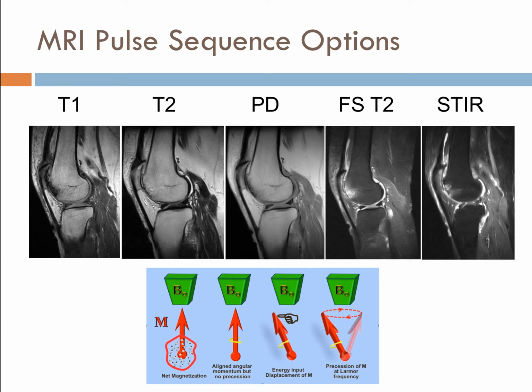That's a very, very simplistic overview of what goes on in MR. It's quite a complex piece of technology, but it gives you an idea about the power of MR as an imaging tool, and the fact that using that very high strength magnetic field and flipping hydrogen protons has a little bit of danger associated with it. With the RF, as I said before, if you put a metallic material inside, not only does it create artifacts, but it can heat up.